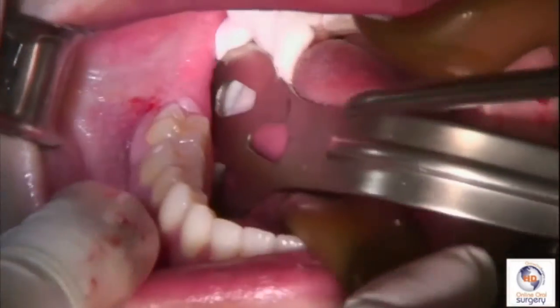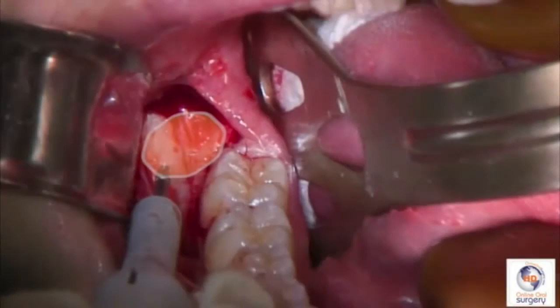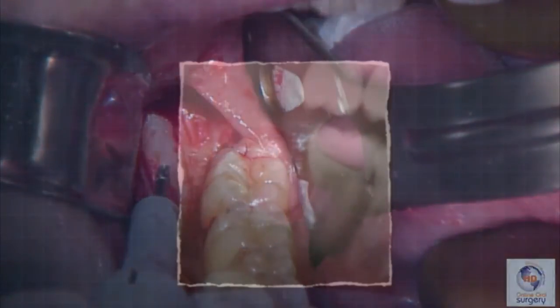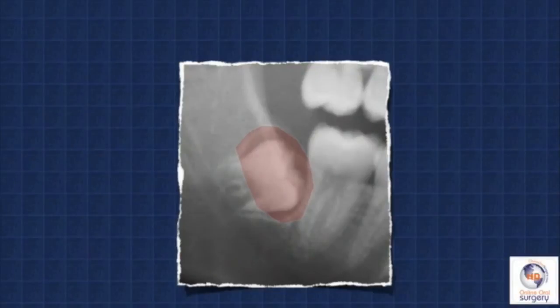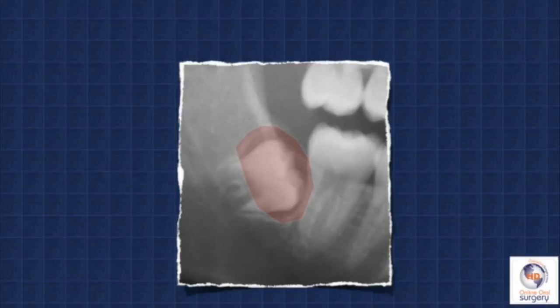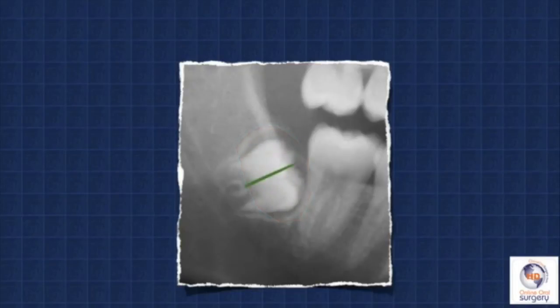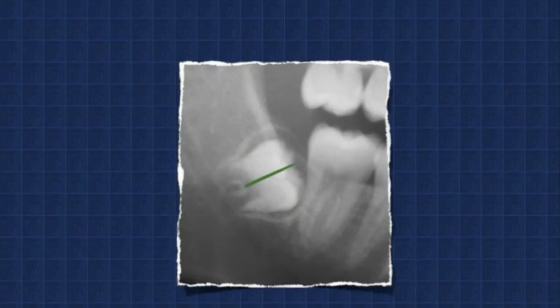We begin by placing a throat pack and retractors in order to isolate the area. We're going to use our surgical handpiece to sweep away the bone that's covering the tooth. The bone we're going to need to remove is on the occlusal aspect of the tooth but also extending onto the distal and mesial regions so that we can completely see the crown. Because this tooth is mesioangular and not quite as vertical, in order to get the tooth out, since it won't come out in one piece, we're going to have to bisect the crown, and then that bisection is going to carry down through the roots so that we can take out the tooth in two individual pieces.